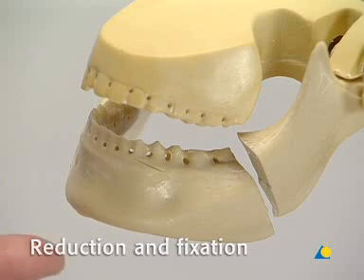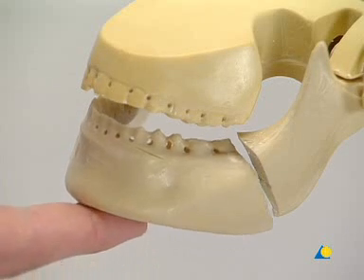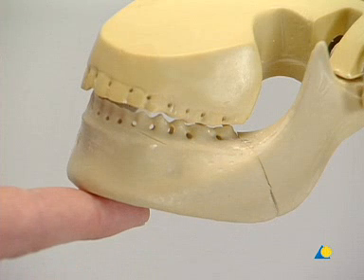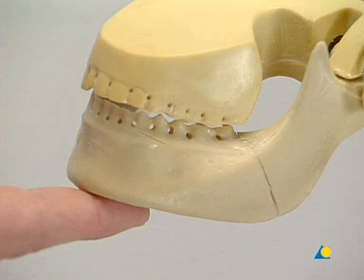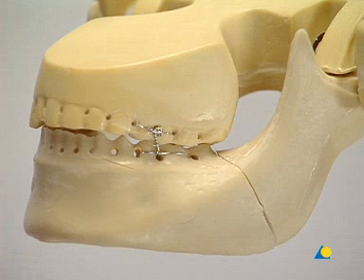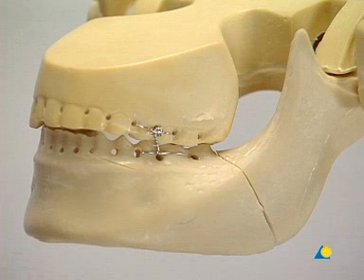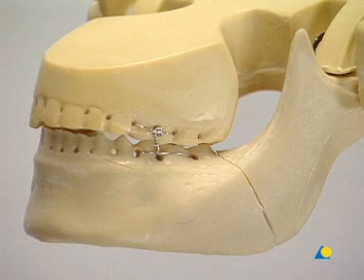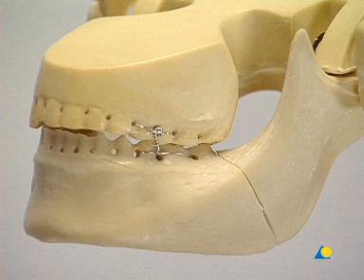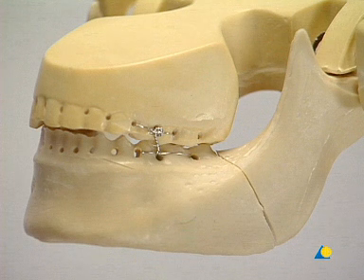Open reduction and stable internal fixation in the dentate patient begins with fixation of the occlusion. For this exercise, Ernst ligatures have been selected. However, it should be noted that many surgeons prefer MMF with arch bars because of the increased stability.